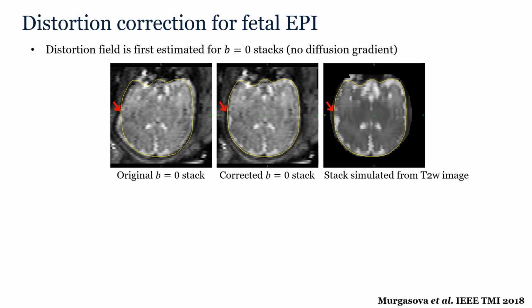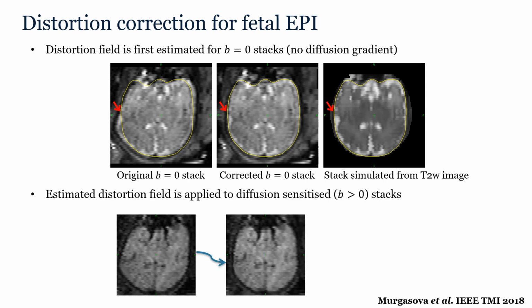The distortion was estimated using the non-sensitized B0 stacks, and in this example you can see how the distortion was nicely corrected with this method. The same distortion field can also be applied to diffusion sensitized stacks, as you can see in this example.